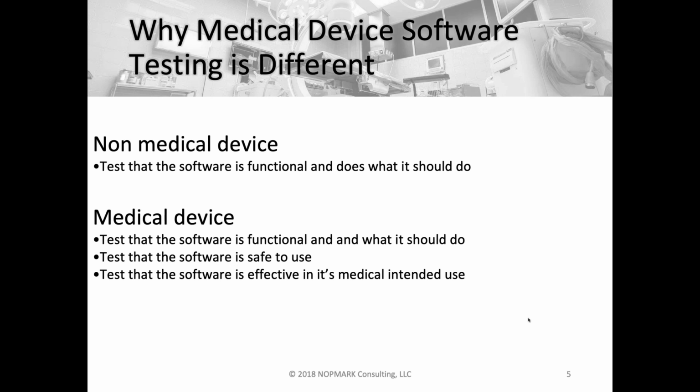So in a non-medical device space, and we kind of abstract it up at a very high level, when we look at our software, we're looking at the functionality of the software. We also look at frequently around the user experience and kind of the look and feel, but predominantly is the software doing what the product owner or the business think the software should be doing? So really kind of focus on that functional aspect. Once we start looking at medical device software, we still have to do all of those pieces.